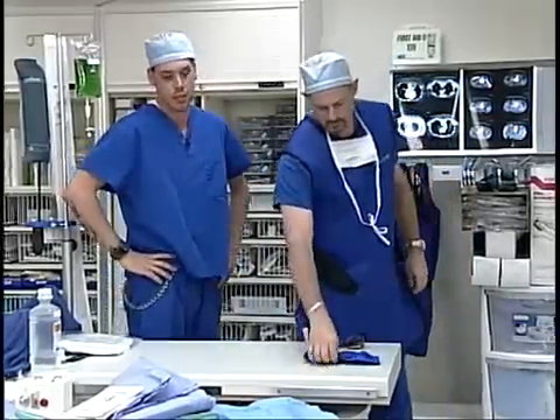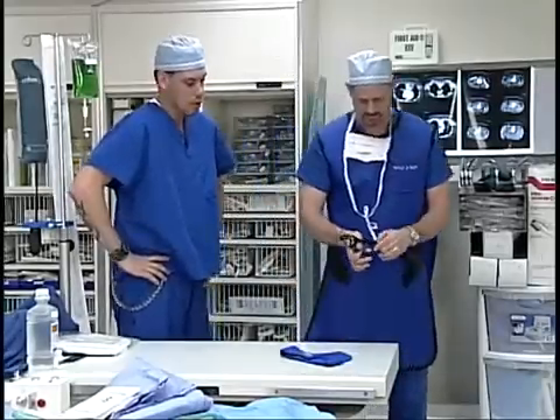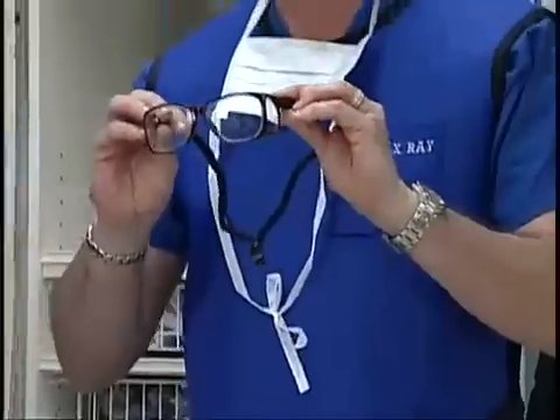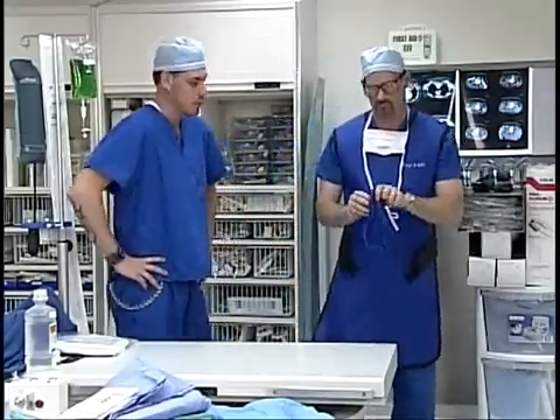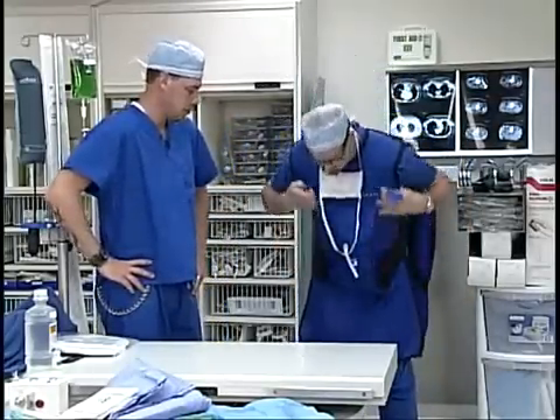You're also going to want to wear some safety goggles. These particular safety glasses have a lead barrier in them to protect your eyes from the x-rays. You're also going to need something called a thyroid collar. The thyroid collar goes around your neck and that protects your thyroid from any x-ray exposure.